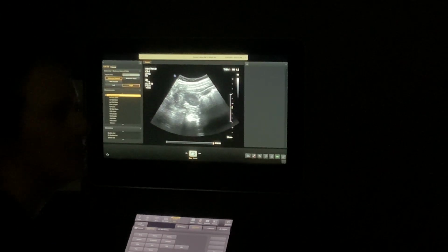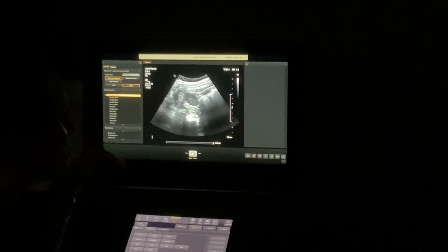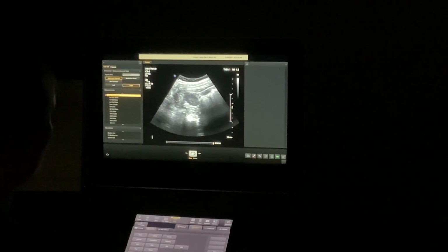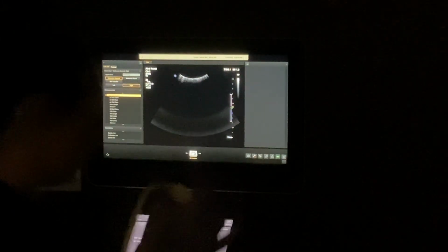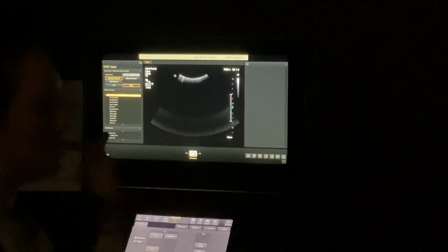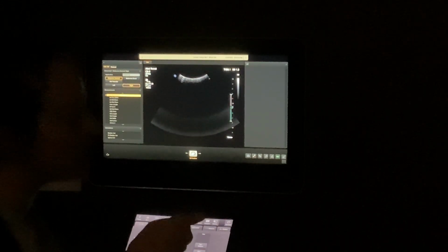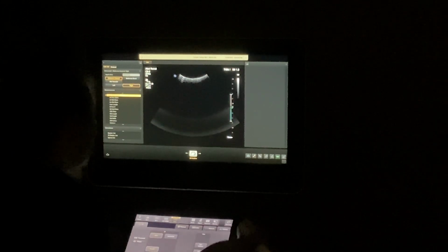That's inferior. Same as the superior, we're not seeing the sinus or the vessels. If you have a little bit of sinus in there, that's fine. But all the way through the organ and then back. Okay? Lather, rinse, repeat for the left kidney. Only thing I will tell you about the left kidney is you're probably going to be fighting more gas and more ribs. So you, in all likelihood, will be decubing your patients for the left kidney. It is generally the better pictures, but try it in supine anyway, see if it looks good.